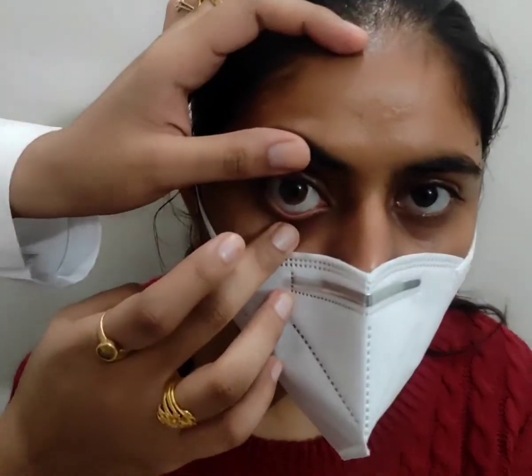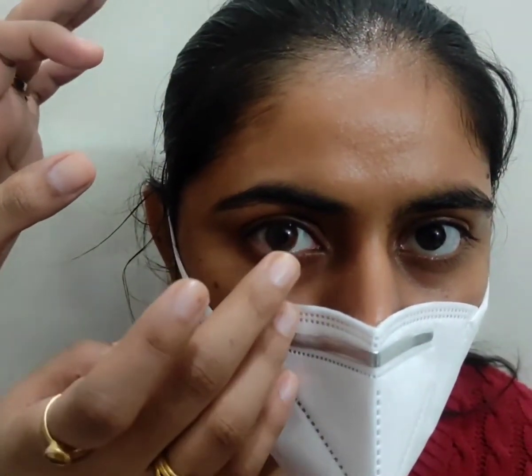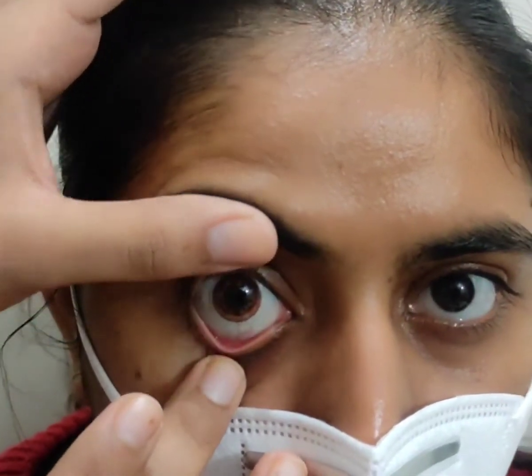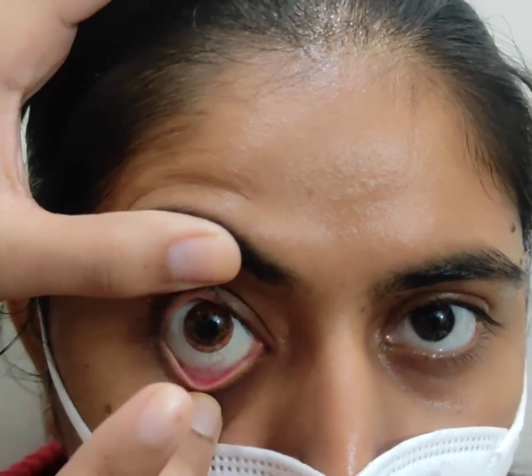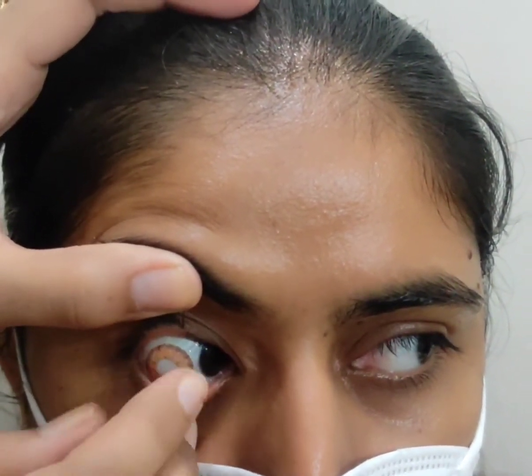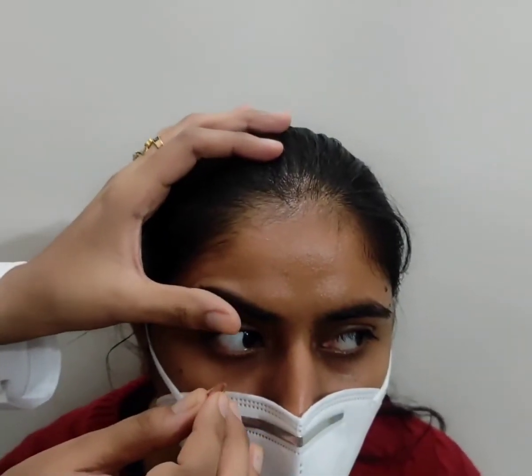The next step is removal, which will be done by the pinching technique. Ask the patient to look nasally while the practitioner retracts the bottom lid with the third finger of one hand and the top lid is retracted with the thumb of the other hand. Touch the lens and slide it onto the temporal sclera and pinch the lens gently out. Ensure that the fingernails do not touch the lens.